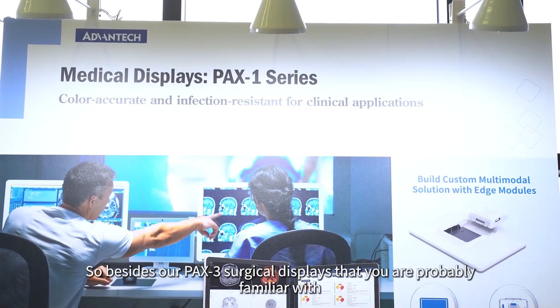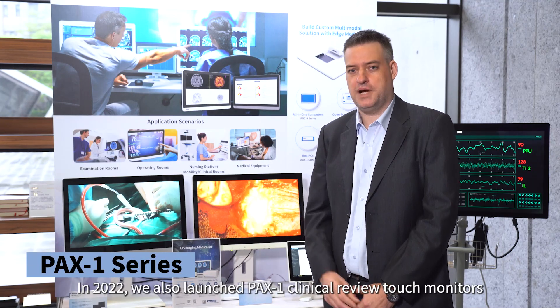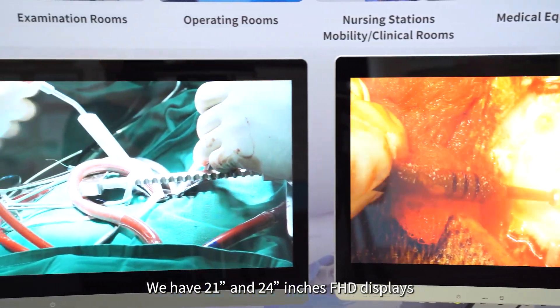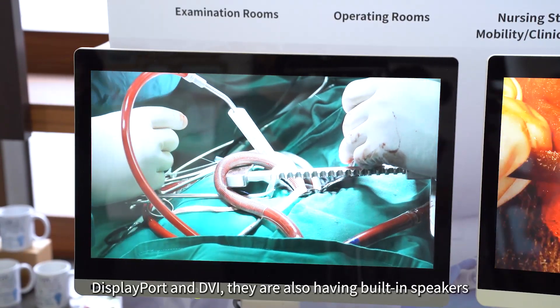Besides our PAX3 surgical displays that you're probably familiar with, in 2022 we also launched our PAX1 clinical review touch monitors. You can see here we have 21 and 24 inch FHD displays. They have common interfaces like HDMI, DisplayPort and DVI.